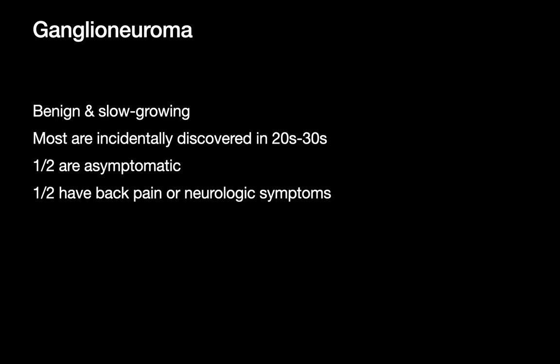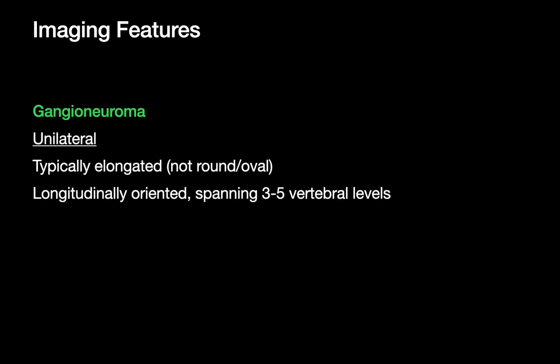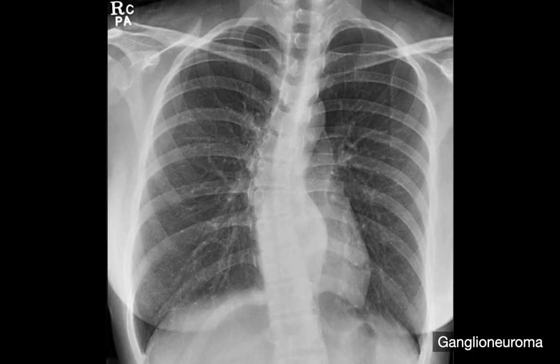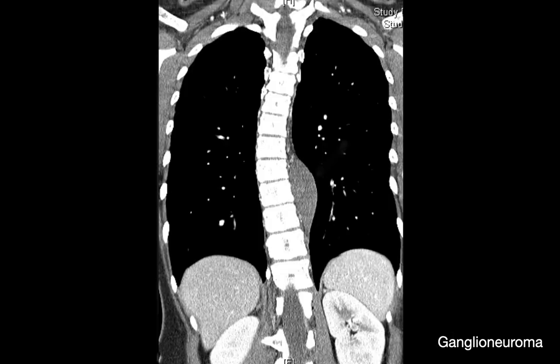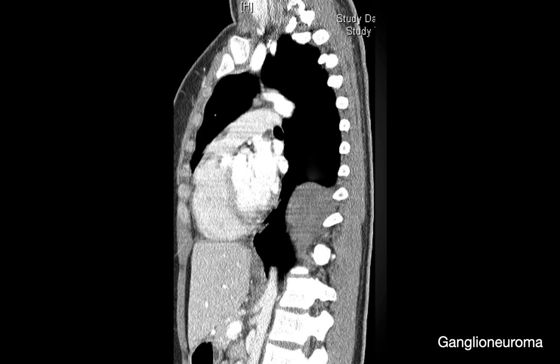Ganglioneuromas are benign neurogenic tumors of sympathetic chain origin. They're slow growing, often incidentally discovered in early adulthood, and some patients are asymptomatic. Ganglioneuromas are usually unilateral and often have a more spindle or elongated shape, longitudinally oriented in the posterior mediastinum spanning several vertebral body levels. On coronal CT MPR, you can see a well-circumscribed posterior mediastinal mass that is relatively spindle-shaped.